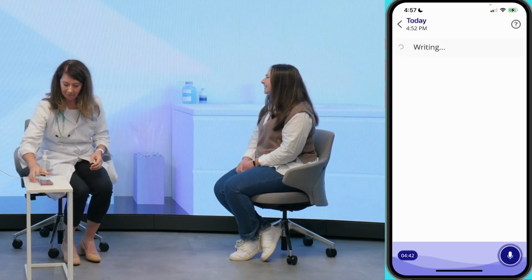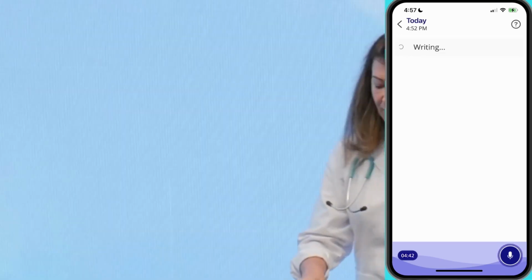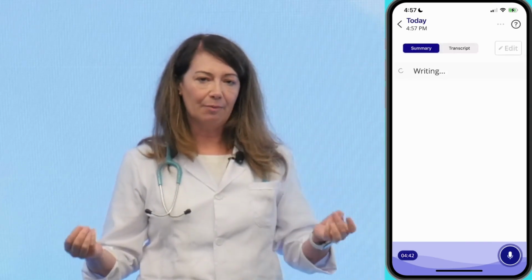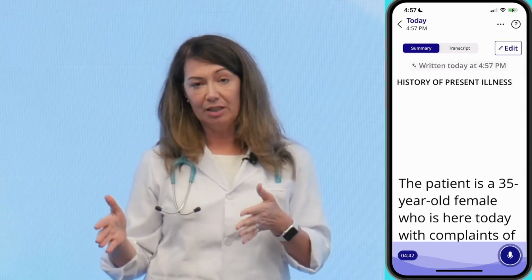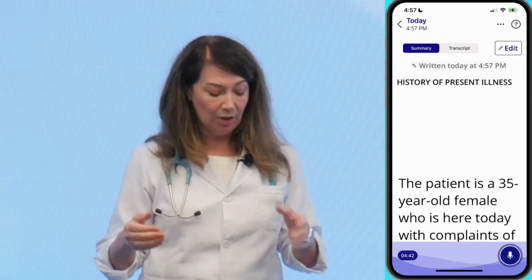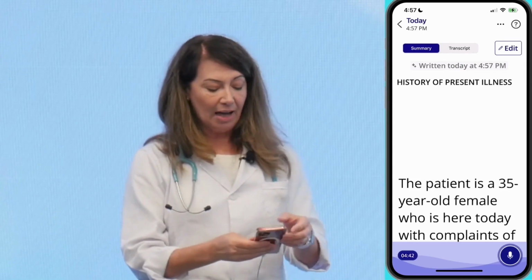Bye-bye. Bye. So in a moment, we'll be able to see what the AI was able to generate from that conversation. We'll be able to see this information directly within the mobile application. Now, the clinician can go ahead and start editing this information directly within the mobile app, should they choose to do so. So we can see that it's already back.